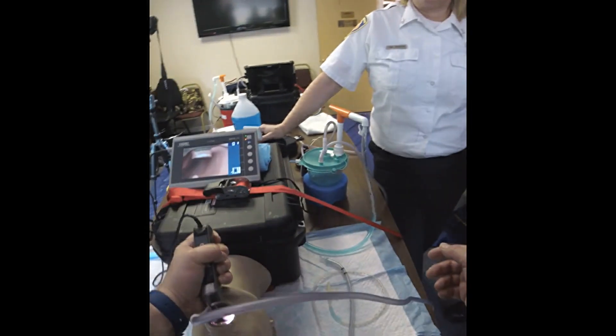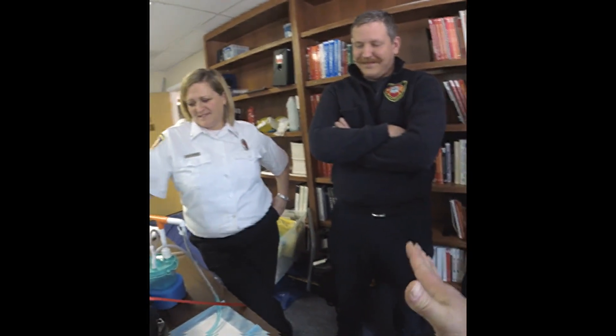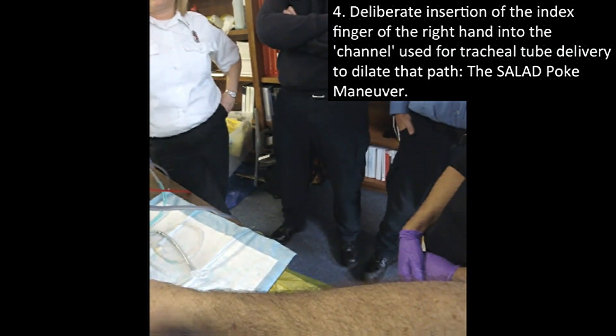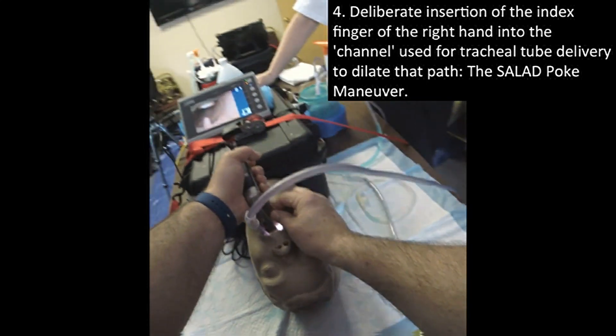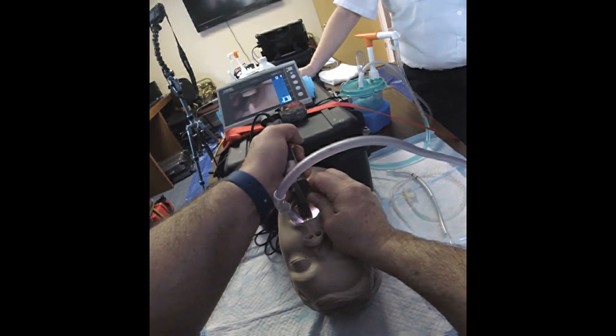Let's say you get called into action by the new Space Force — you'll be handed GlideScopes or super GlideScopes. This is the mistake you can make where you can't intubate. You can't intubate this; there's no room for tube delivery. This is where the salad poke comes in. The salad poke not only creates the space for tube delivery, but it's also a modification of grabbing the laryngoscope so that I can move it in and out.